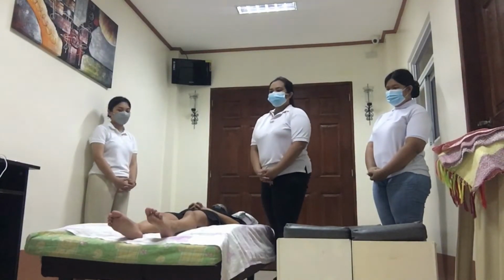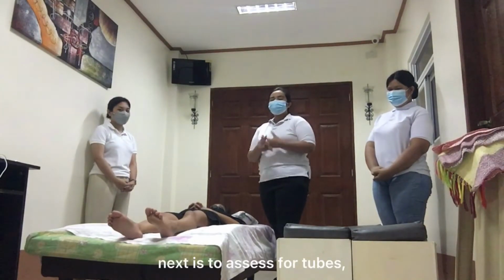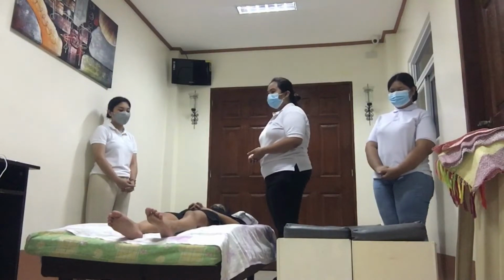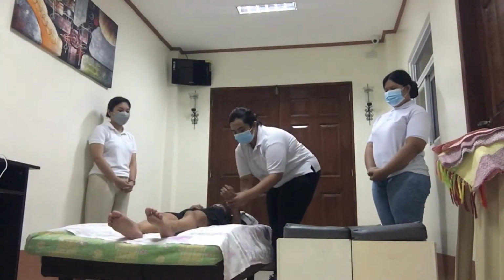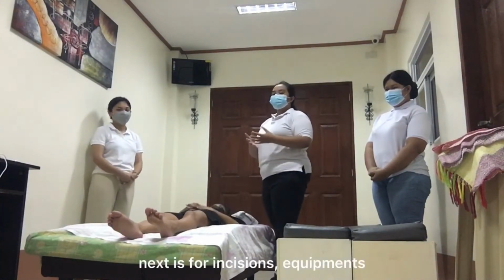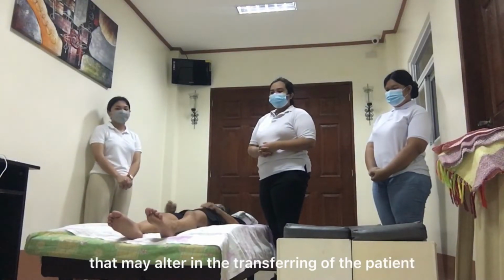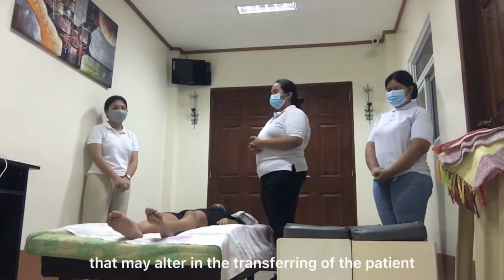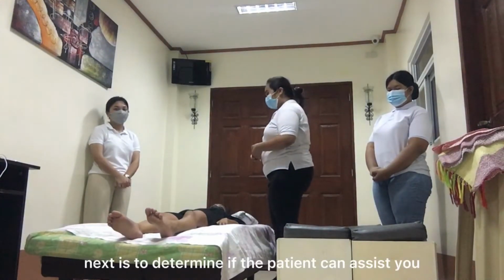Next is to assess for tubes, intravenous lines. Usually, it's put here or in the other hand. Next is for incisions and equipment that may alter the transferring of the patient. Next is to determine if the patient can assist you.